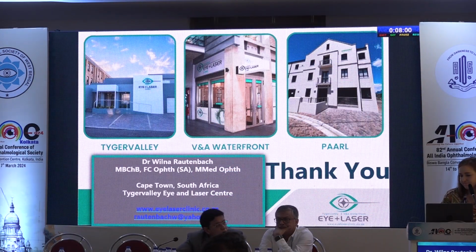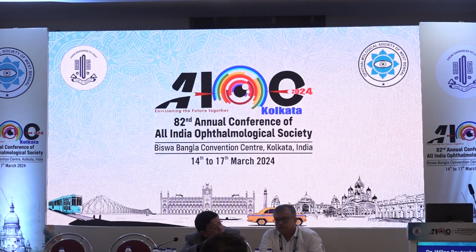Thank you. Would you ever consider doing a topo-guided PRK to regularize the cornea before taking up the patient for cataract? Yes, of course. That patient specifically, because he was quite traumatized from his previous LASIK, told me he doesn't want corneal surgery at all. So he wasn't motivated, but he was counseled that it's a high possibility also after surgery.